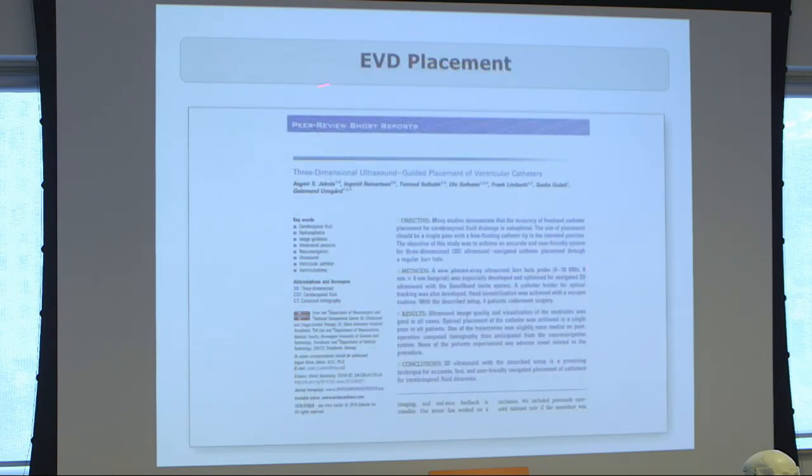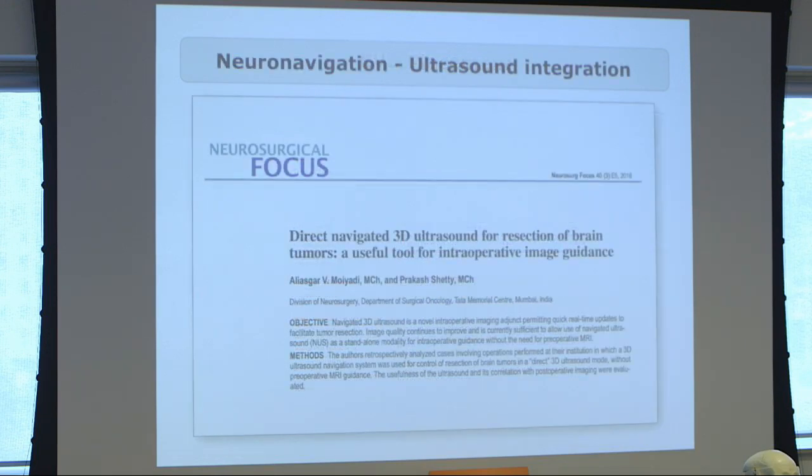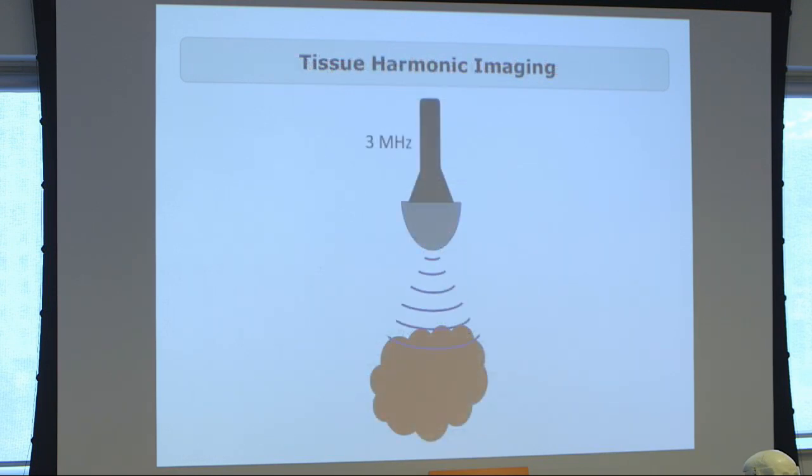This is his group here, and they've been able to show the many advantages that this system has over its competitors. Now, I've only got 2 minutes left, but just so you've heard about it as well, tissue harmonic imaging is a modern technique which enhances the quality of your images, because everyone's criticizing the quality of ultrasound images, but the question is, what information do you actually need, but also how can I improve the image that I'm working with? And tissue harmonic imaging is an interesting and pretty simple technique.